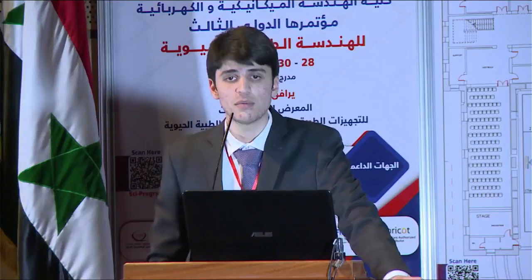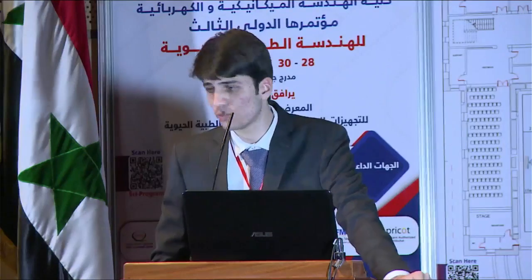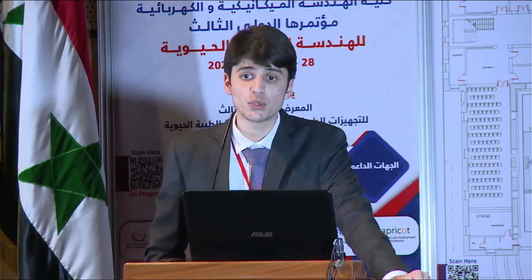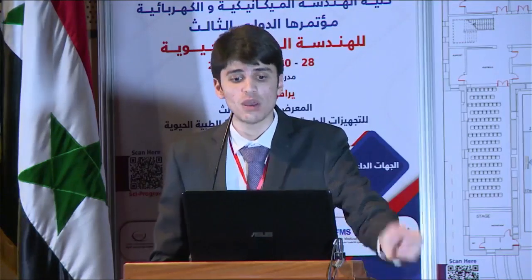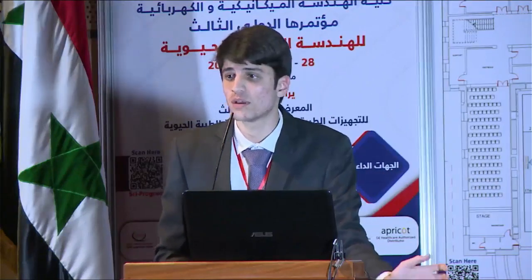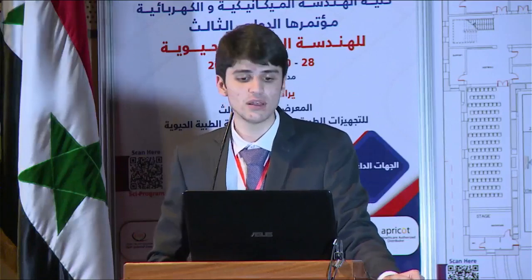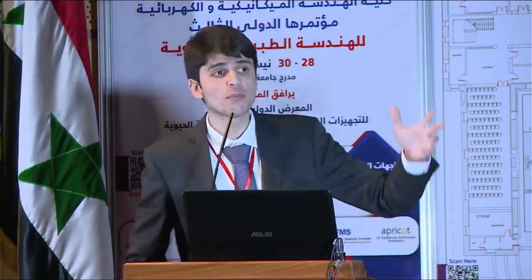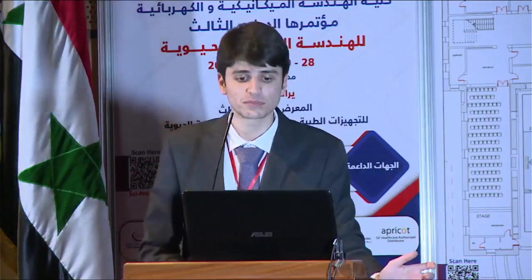For the materials, we decided to take 3 main materials: POM, polyoxymethylene acetal copolymer. We all know that POM is used in the SACH foot keel. The second one, cobalt, is a 3D printed metal. And finally, we have the GFRP, to make a comparison with the study of Muhsina.